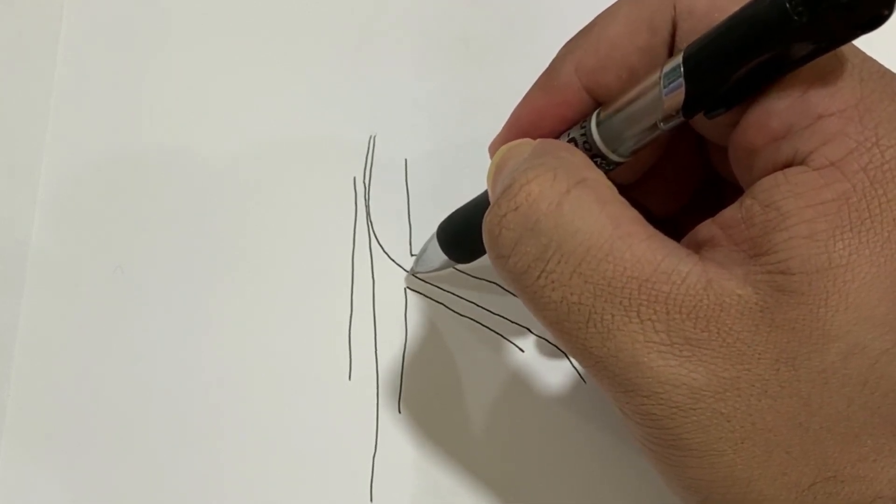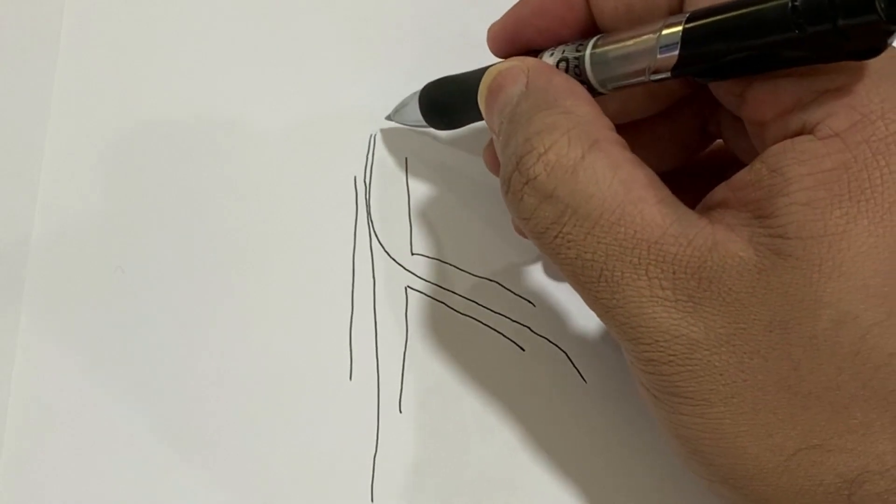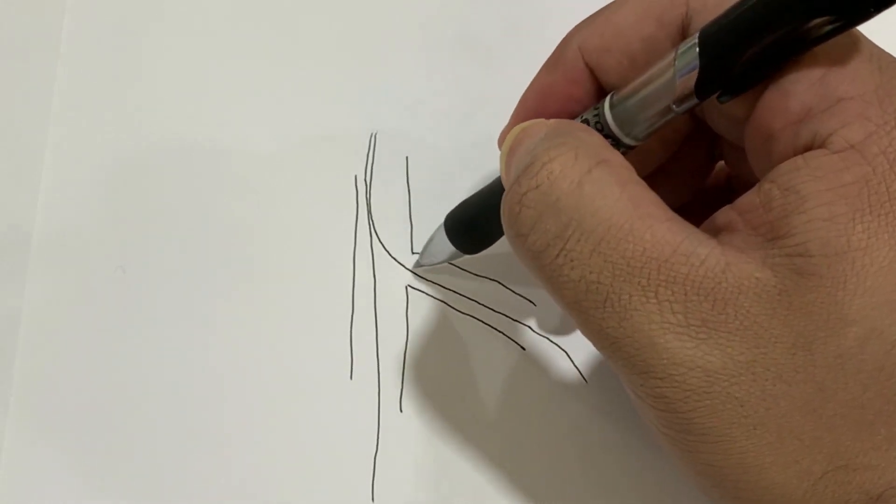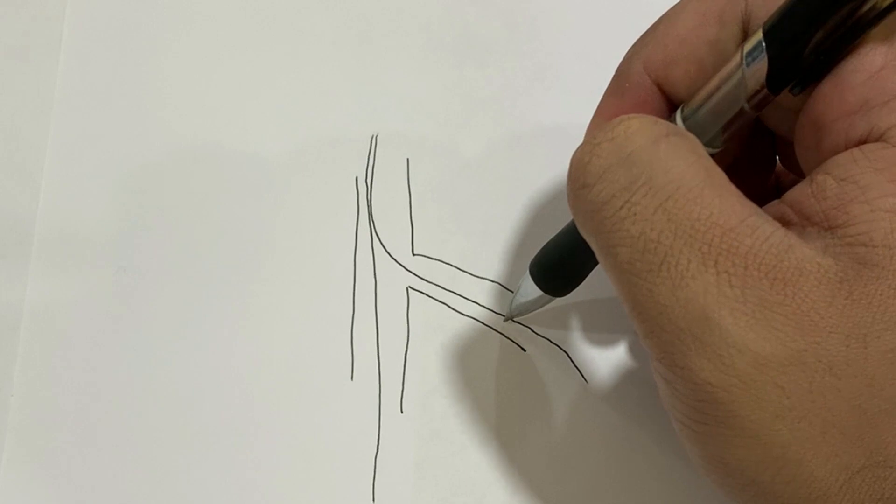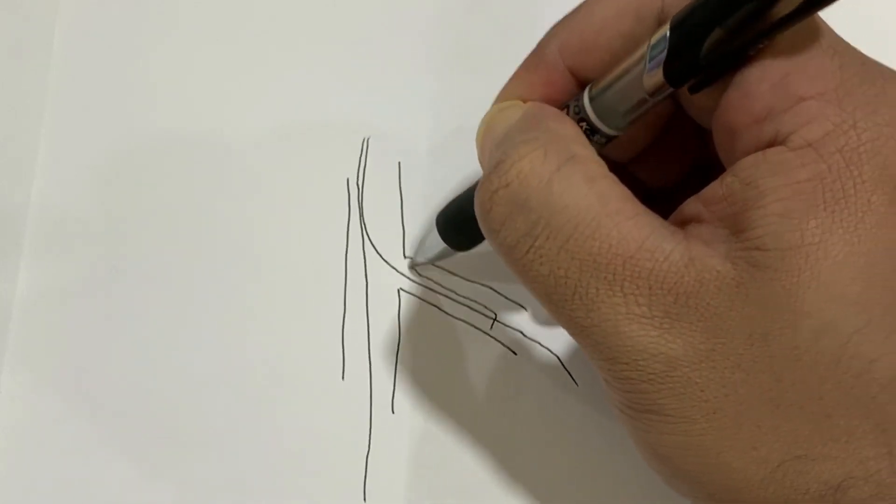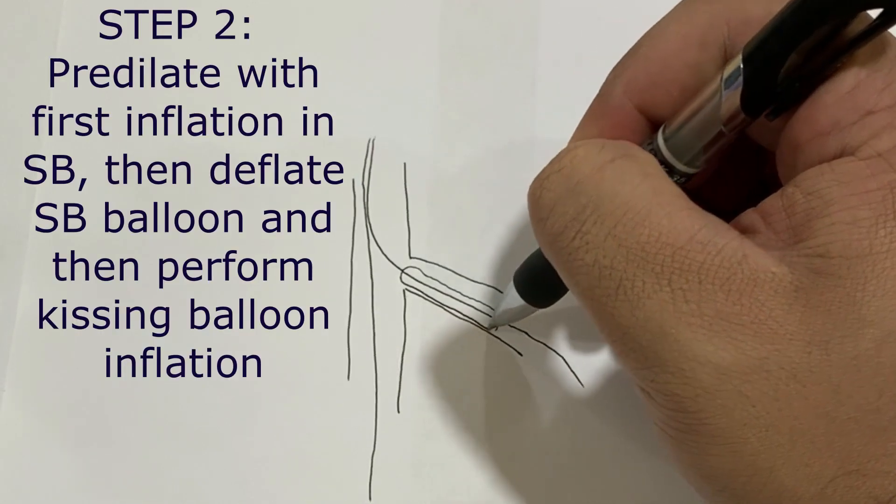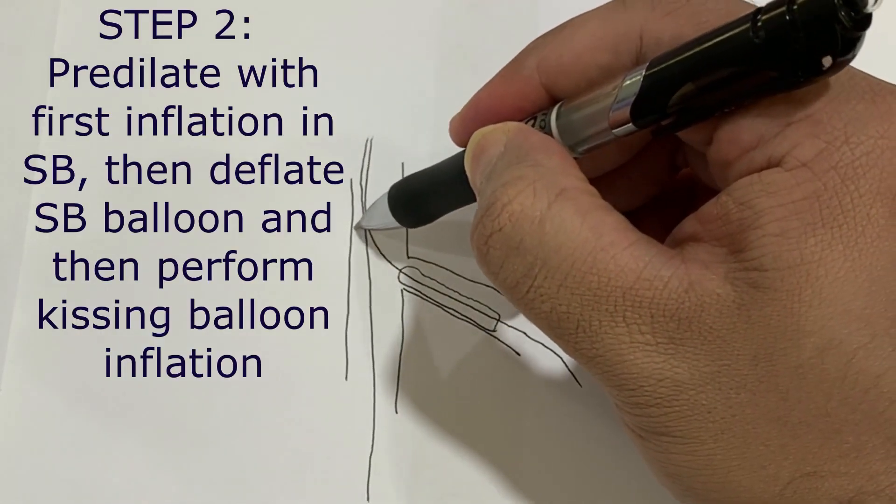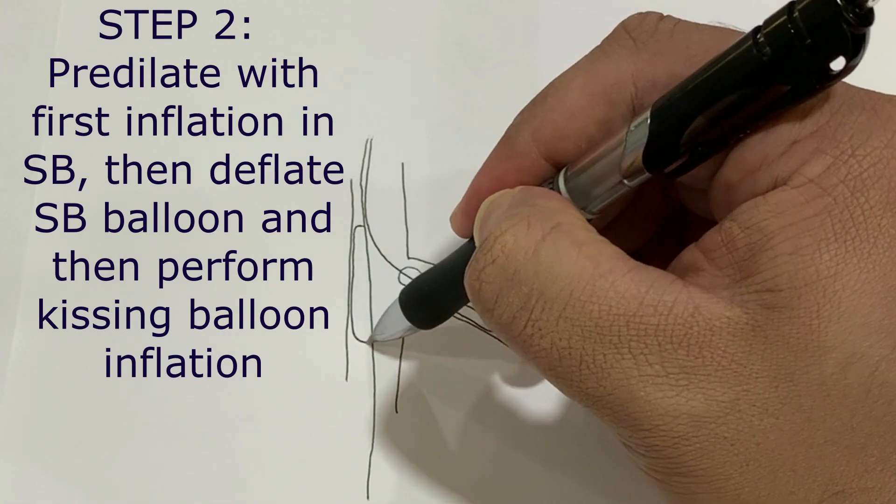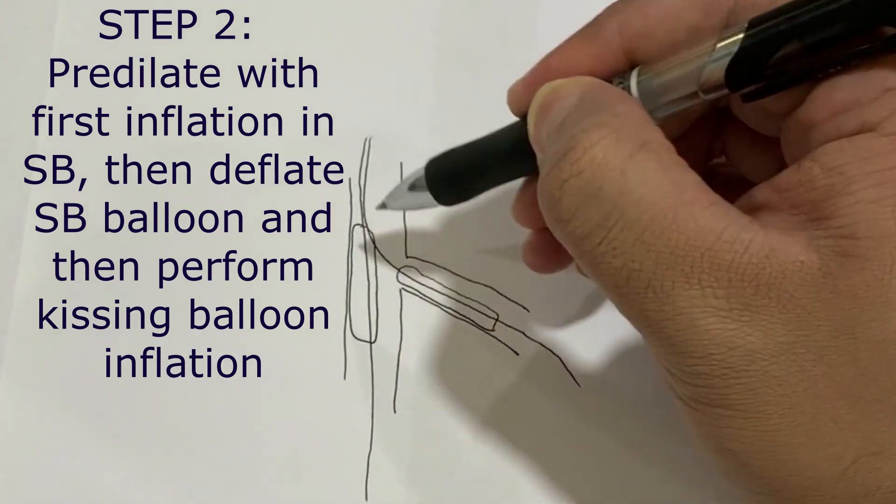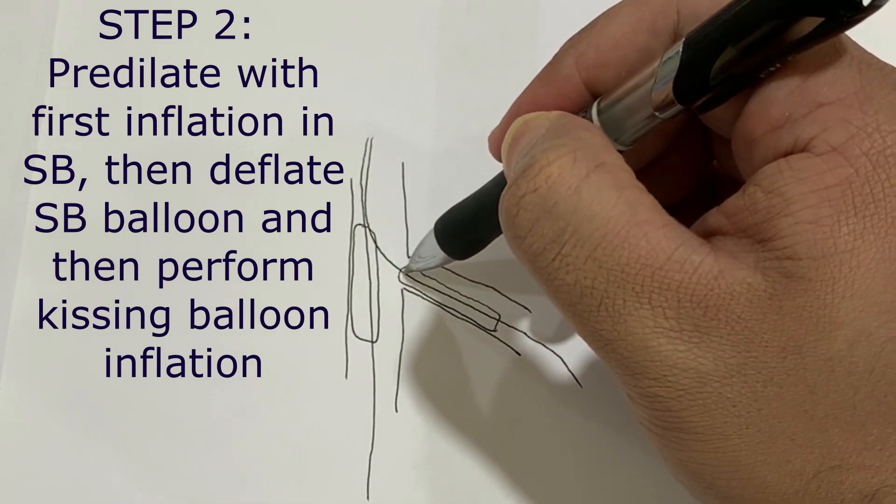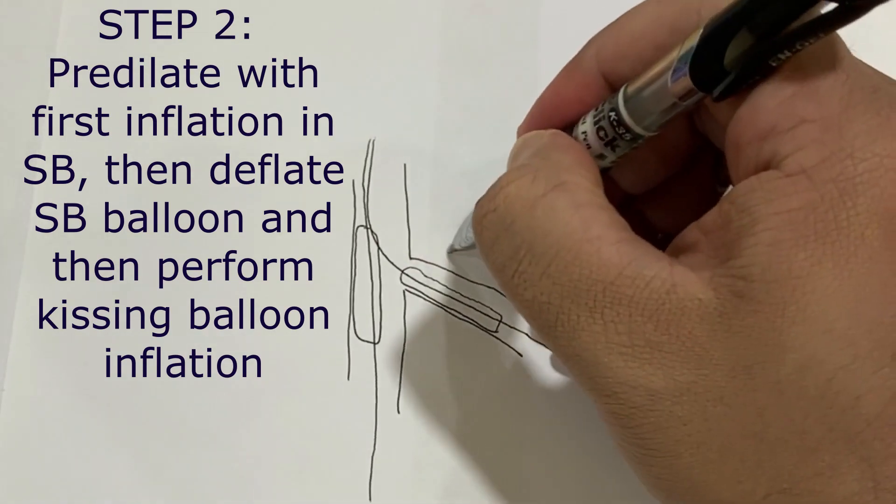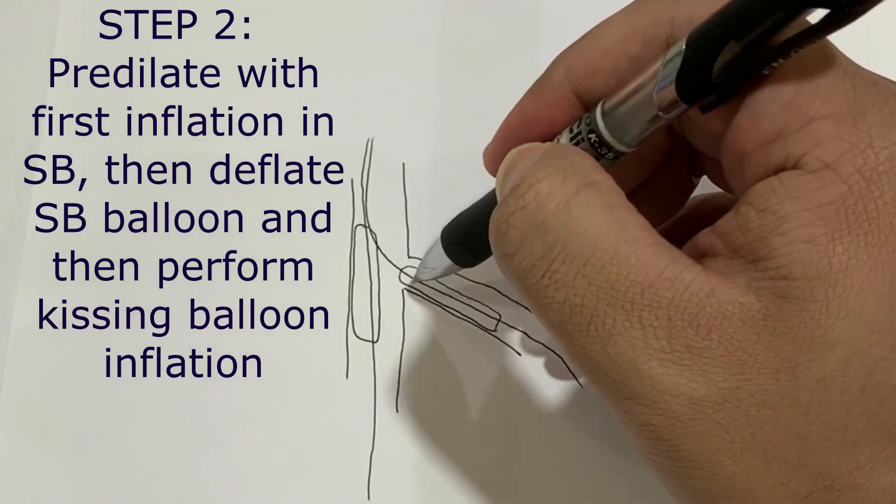Once you have wired these, try to use this wire as the more supportive wire. Bring a compliant balloon if you are using a six French guide to this wire. Bring another balloon, preferably NC, on this wire.